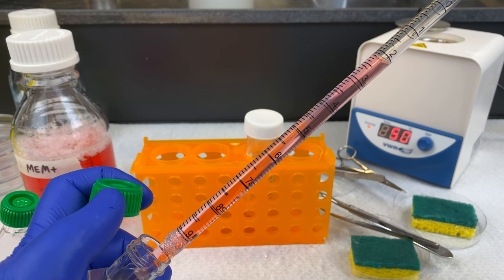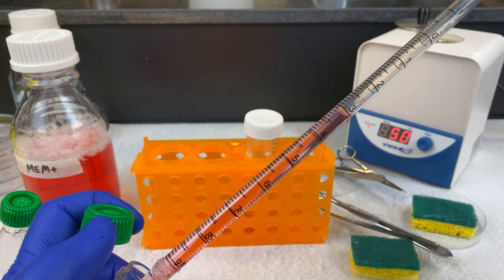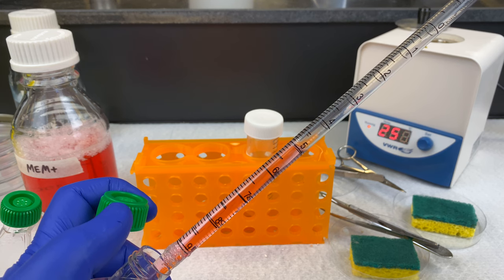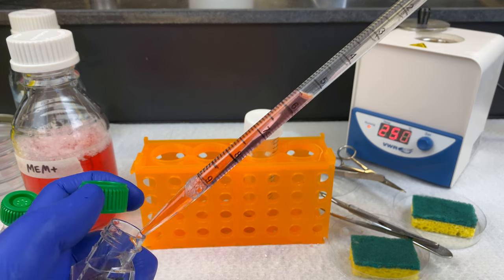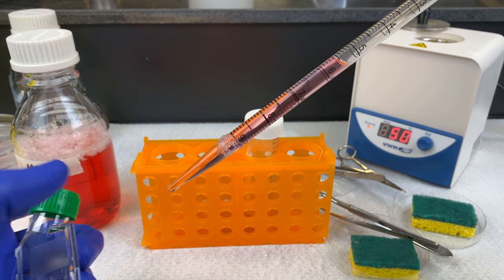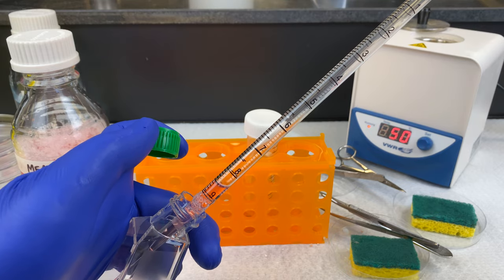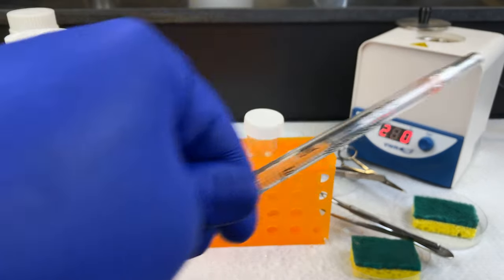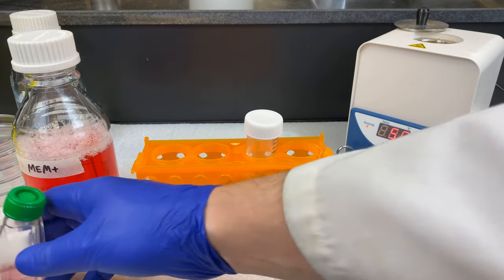I will grow these up overnight, come back the next day, and determine which one would be the best flask to stay with. If the concentration is too high, I'll throw that one away. If it's too low, I'll throw that away as well. I'll take the one with the best concentration — our Goldilocks flask — and we will try and culture that.